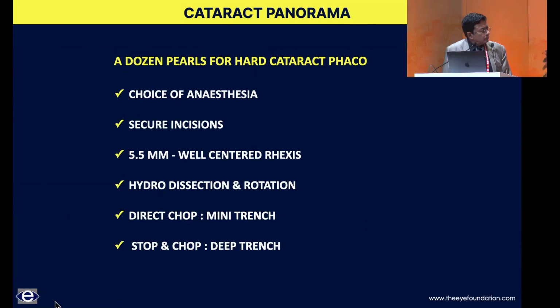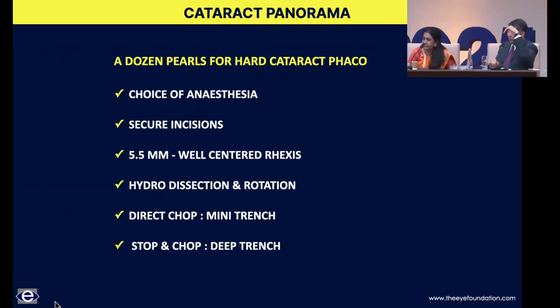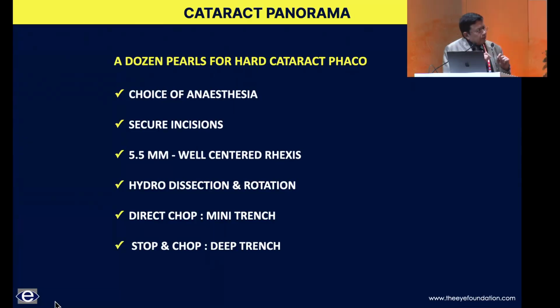And I find when you're with a sharp vertical chopper, you have to chop and then just wait a little bit. You just imagine you're propagating that fracture a little more with that pressure. And then you just start slowly, that's a very important click. Yeah. And also the concept of multi-level chopping, in the sense that you keep a hold on the nucleus very firmly, but go level by level, so that ultimately the point is to split the backbone of the nucleus. As far as you have divided this and it has propagated through and through.